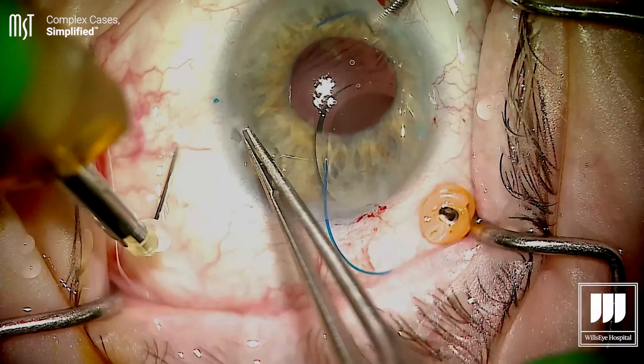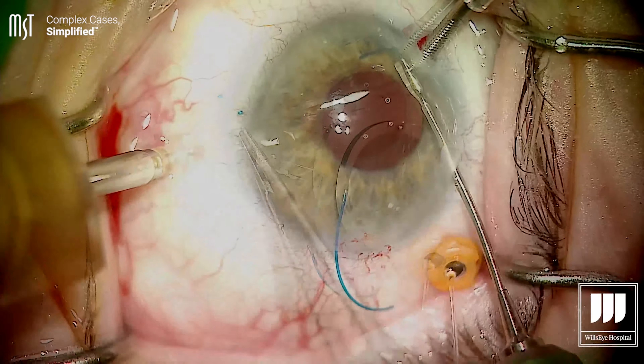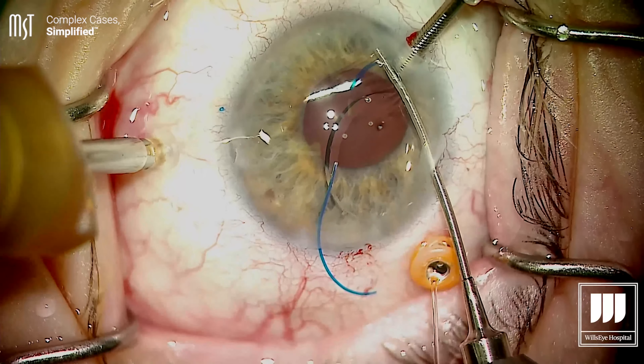Some of the key steps are making sure that your scleral passes with a thin-wall 30-gauge needle are even on both sides of the eye — about two millimeters in length in the sclera. The leading haptic, the first one you incarcerate into the lumen, is usually fairly straightforward. It's the trailing haptic where a lot of people have problems. A key tip: do not externalize the first haptic. After the IOL goes in and you've incarcerated the first haptic, let the needle go — don't pull it out. If you do, it will rotate the implant and move the trailing haptic into a very difficult position to capture with the second needle.